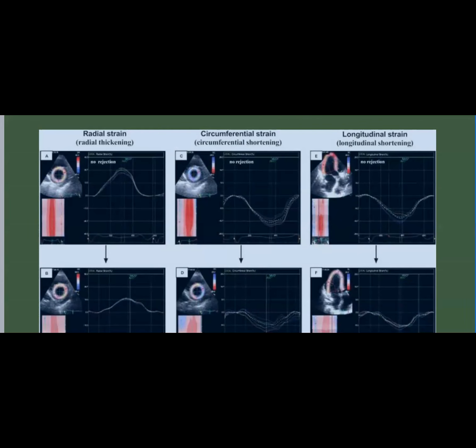But the one that is clinically adjudicated, found to correlate with survival, and to have clinical utility, and is going to replace the ejection fraction, is the global longitudinal strain. Why is that? Because they found that it reflects the systolic function better than the ejection fraction, is more objective than the ejection fraction, and drops earlier than the drop in the ejection fraction.